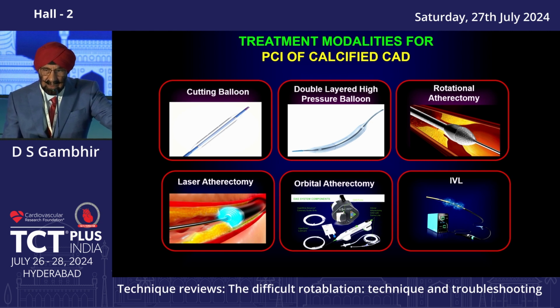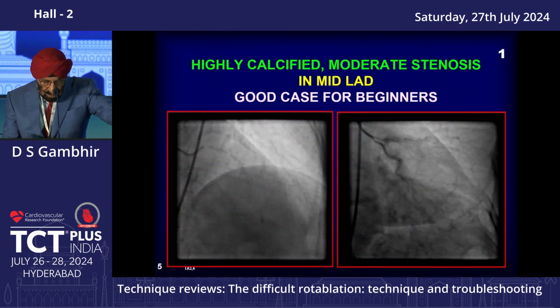Of course, we now have 2 additional devices for calcium. One is orbital atherectomy and the second is intravascular lithotripsy. But they have a niche in selected patients.